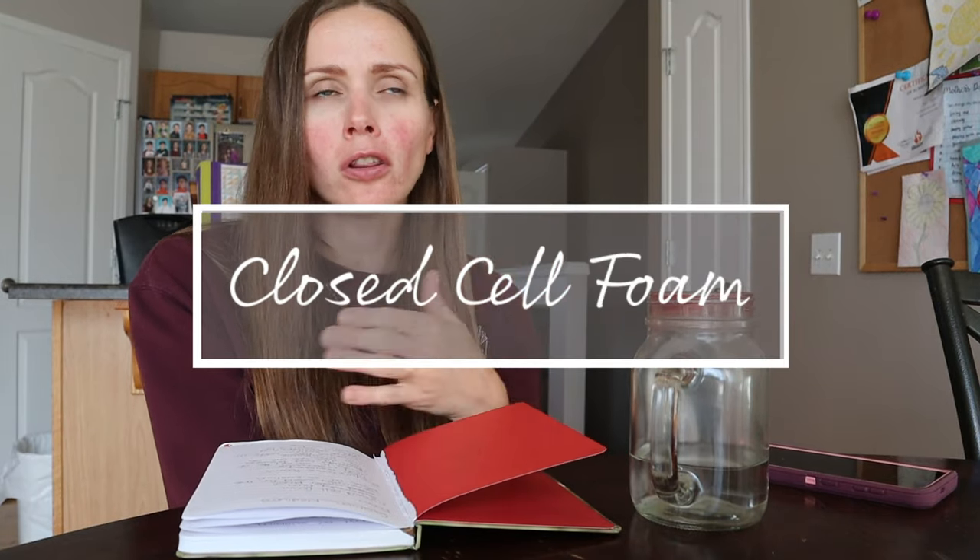Starting with closed cell foam — there are lots of types, but when we talk about closed cell foam in cushions, we're typically talking about really firm types like yoga mats. These are usually the bottoms of cushions because closed cell foam is largely waterproof. If you spill water on a yoga mat you can wipe it off. Closed cell foam is a really good base for a cushion because it has great structure and doesn't lose shape.